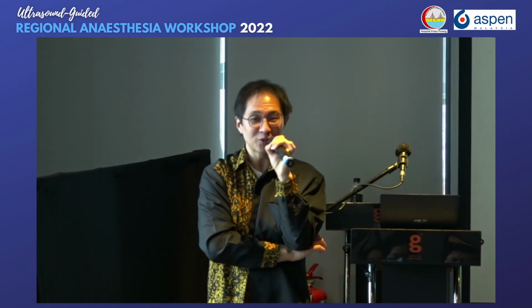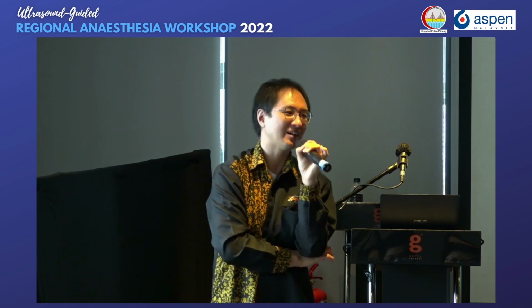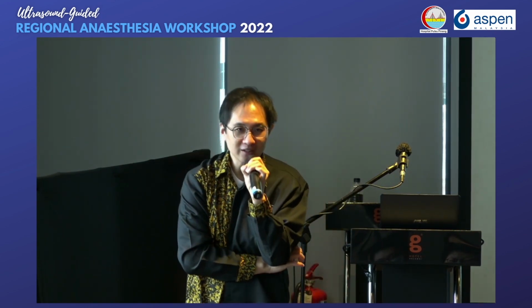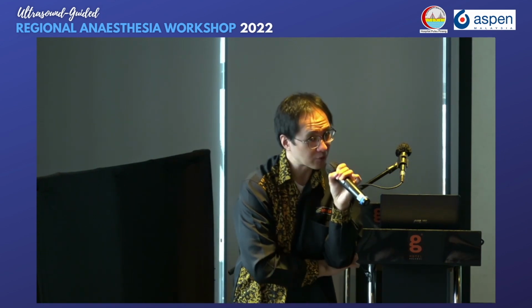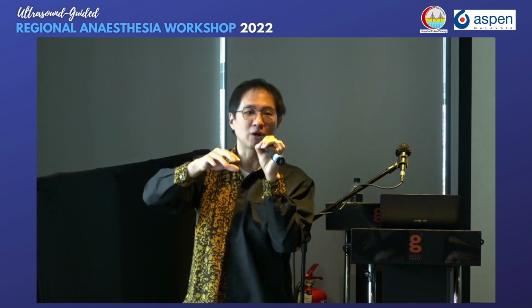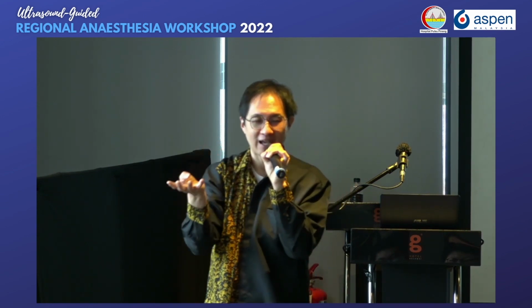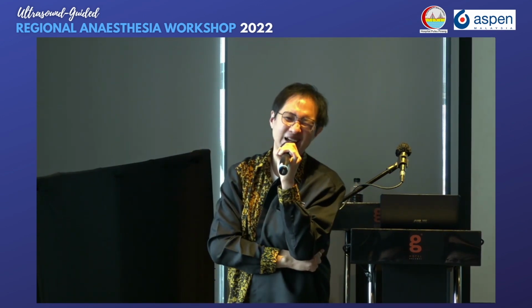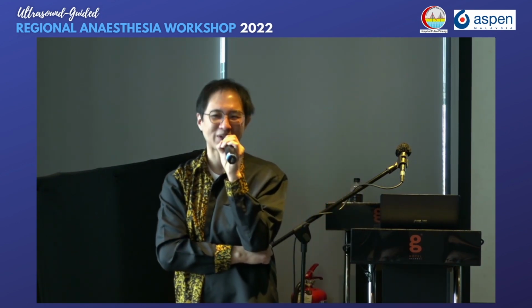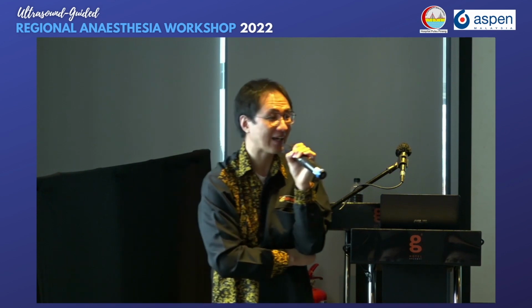Because if you really want to do peripheral nerve blocks, yes, in our experience in HKL, we have done it before. We block the femoral, we block at least a subgluteal sciatic, and to cover the small nerves, we also block obturator and LFCN. We have done AKA using 4 peripheral nerve blocks before. But that was the normal AKA, not the high.